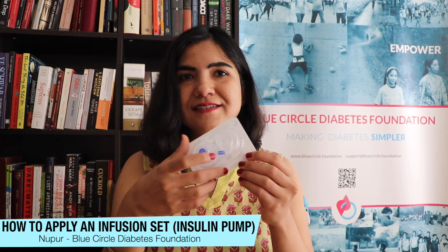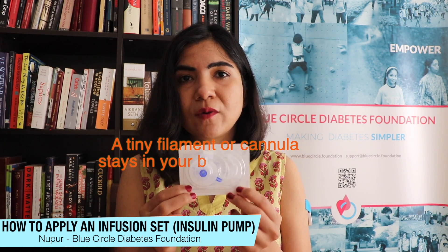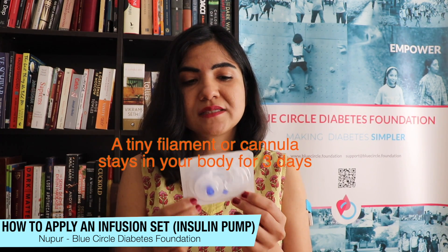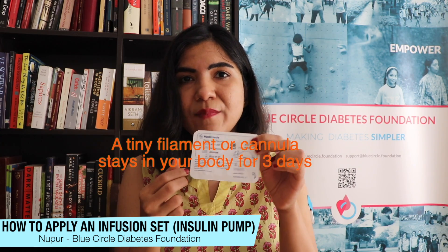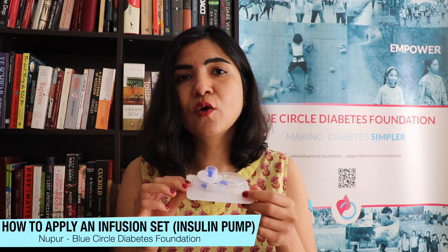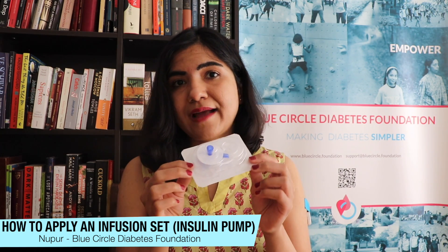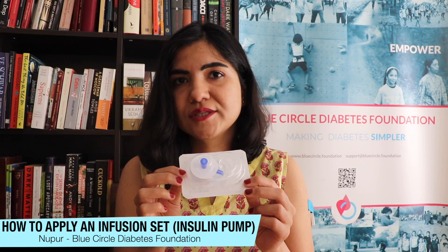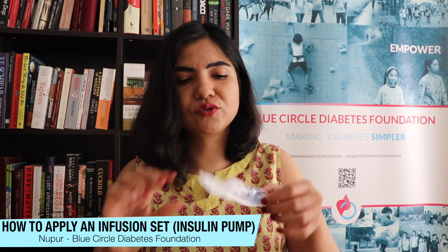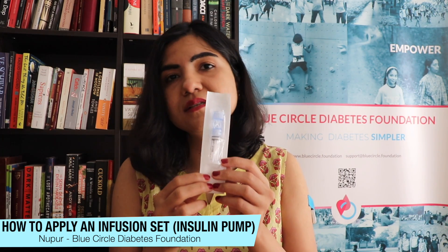How it works: this patch is injected into your body — I'm going to inject it into my torso. There's a filament that stays in your body; in my case I use the 9 mm infusion set, so a 9 mm plastic filament will stay inside my body and deliver the insulin. There's also a tube attached to this infusion set, and then this goes into the reservoir which goes in your pump.